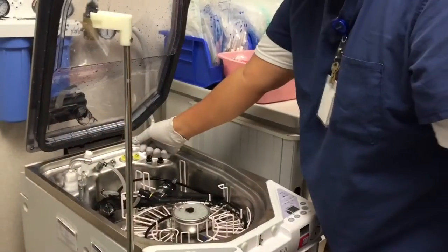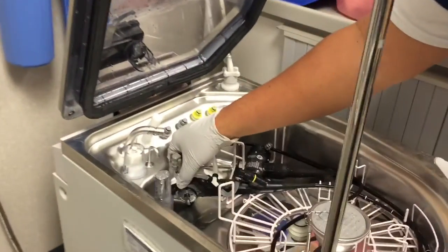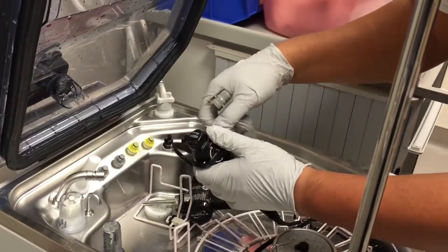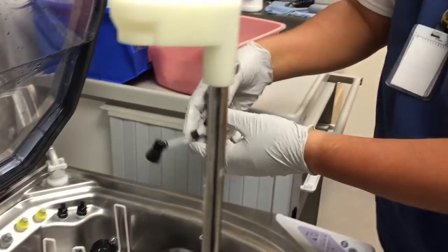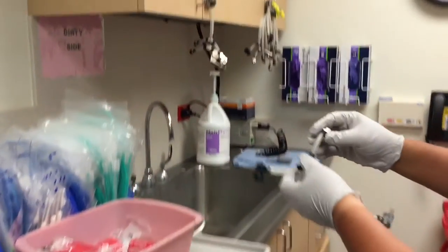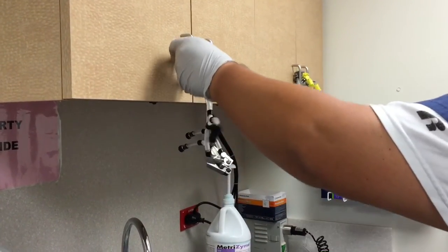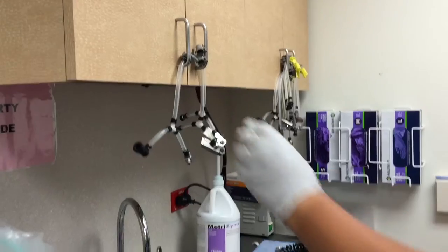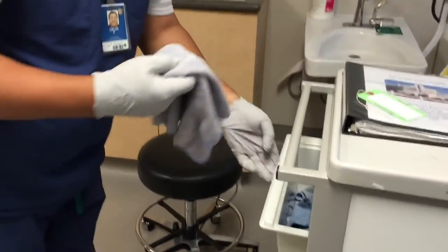And that was it. Taking the scope out of the machine, disconnecting the adapter. He will proceed with a clean and dry towel to dry the scope.